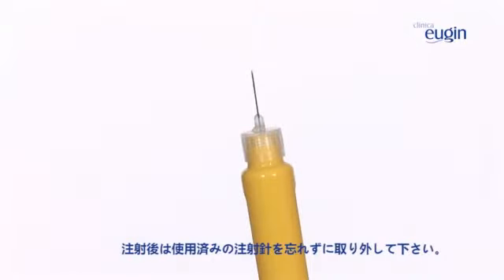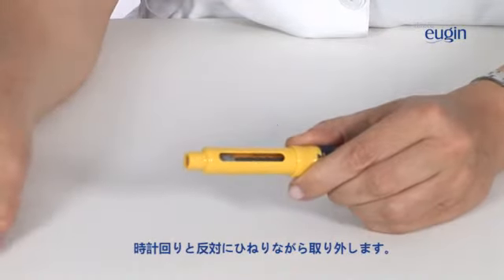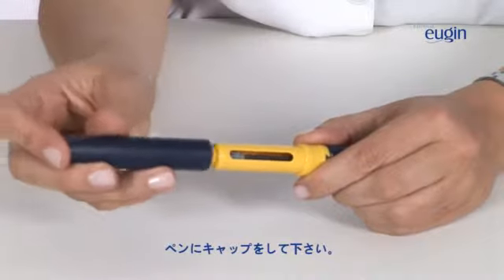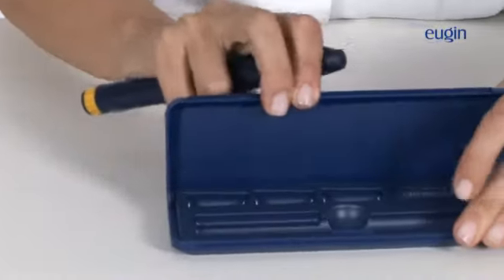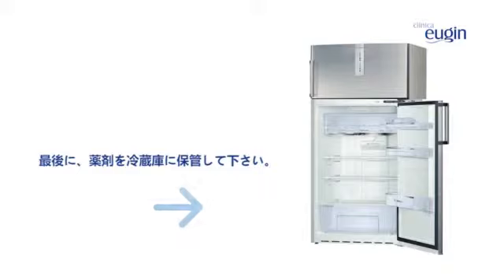After administering the medication, you must dispose of the needle you used for the injection. Unscrew the needle in an anti-clockwise direction. Now, dispose of it in the container we provided. Put the cap back on the pen. Finally, put the medication back into the refrigerator.